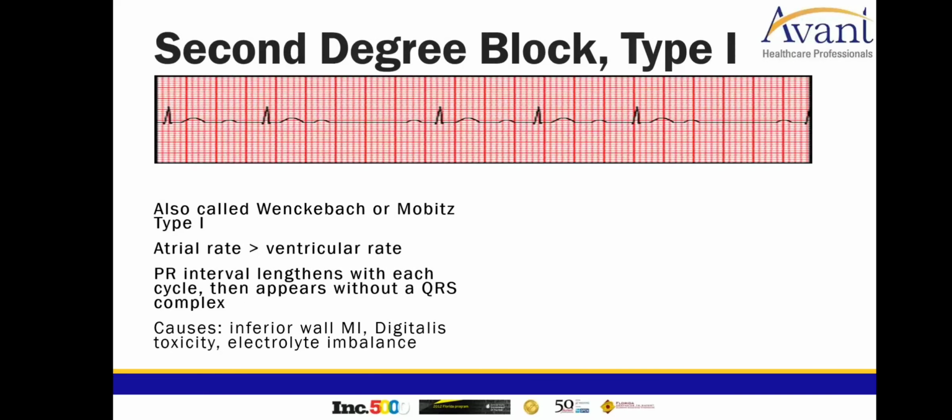I like to think of this one with my little analogy of couples: think about the fighting couple. The P is the wife that gets very angry at the QRS, who's the husband. And not being sexist here, we can turn it around if you'd like. But in this case, the wife says to the husband, you can move over to the other side of the bed because she doesn't really want to talk with him right now. And then says, you got to move over. Really don't want you near me at all. Then sends him to the couch and says, you can go sleep on the couch.